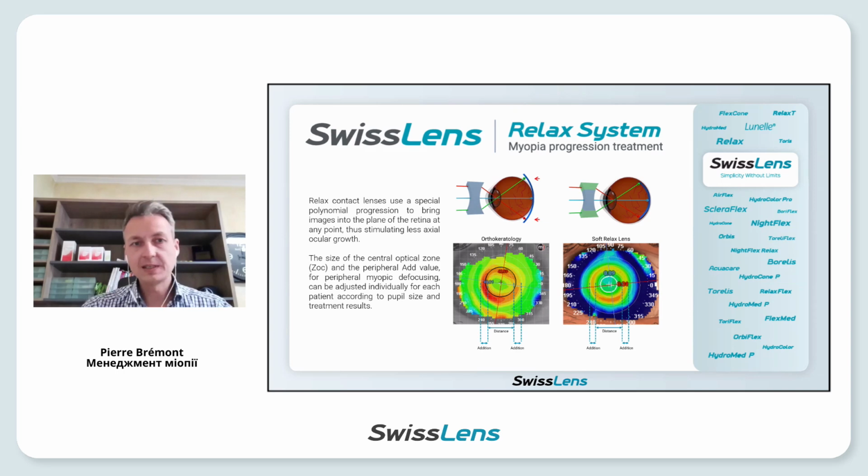And this is the cycle of the myopia progression. So with the Relax system, we make the retinal image in the periphery next to the retina, but mainly in front of the retina, to decrease this need of accommodation.